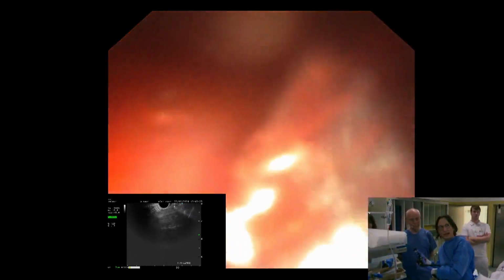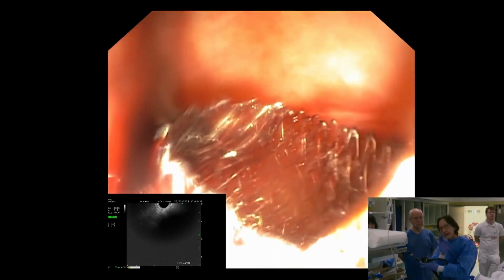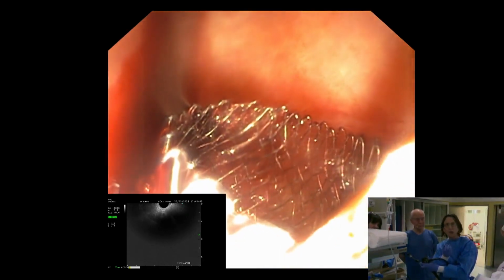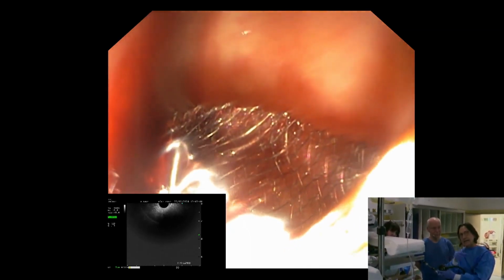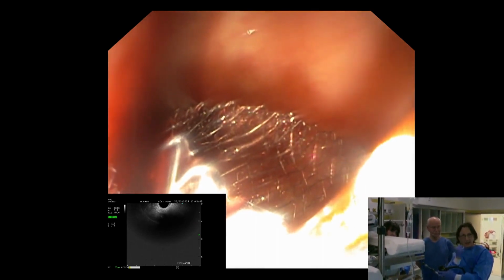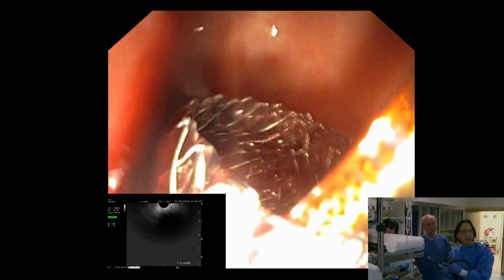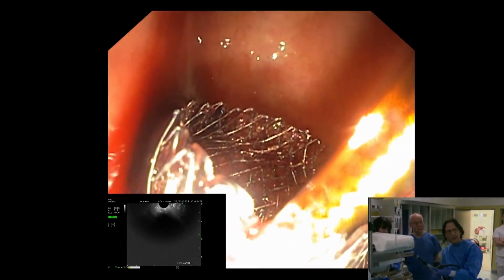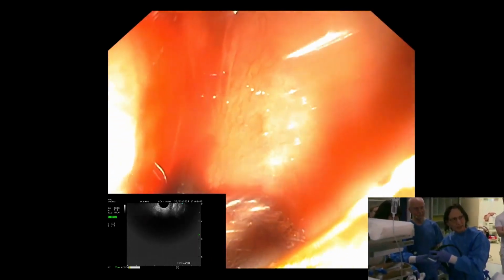And I'm going to use the gray hub to push it out completely. There it is. It just popped out. I'm going to keep it here for a moment. I want to make sure that I don't pull out the cable too fast, because the nose cone is thick at the very tip and it can get caught inside of the saddle and you can accidentally dislodge the LAMS. So I'm just going to hold my position here, try to rotate my body a little bit, and very slowly pull back. But as I do this, I'm looking.